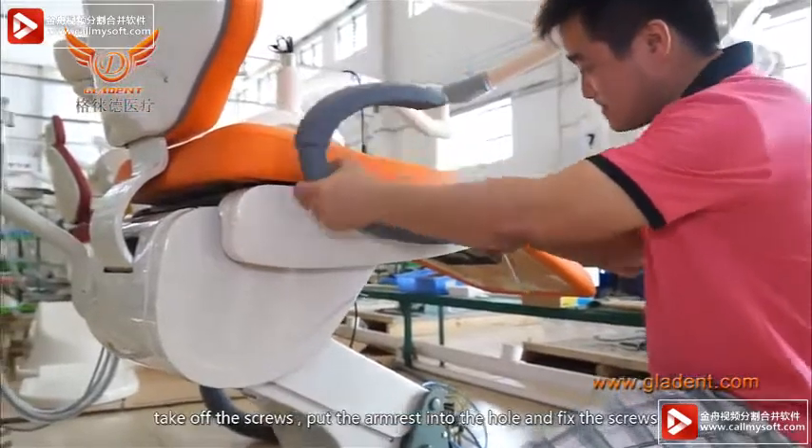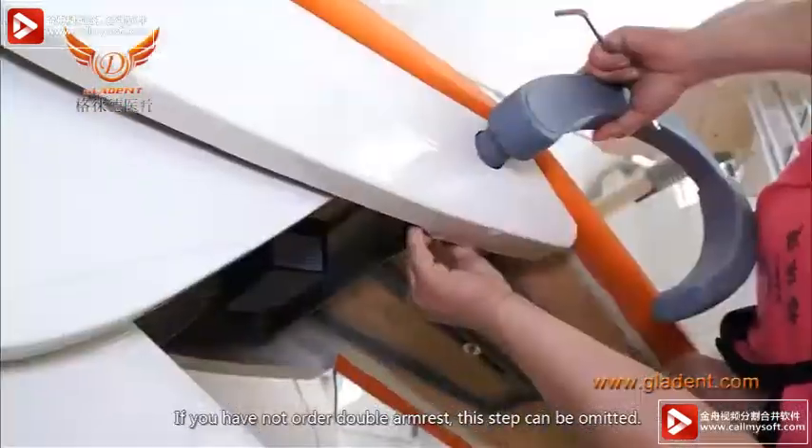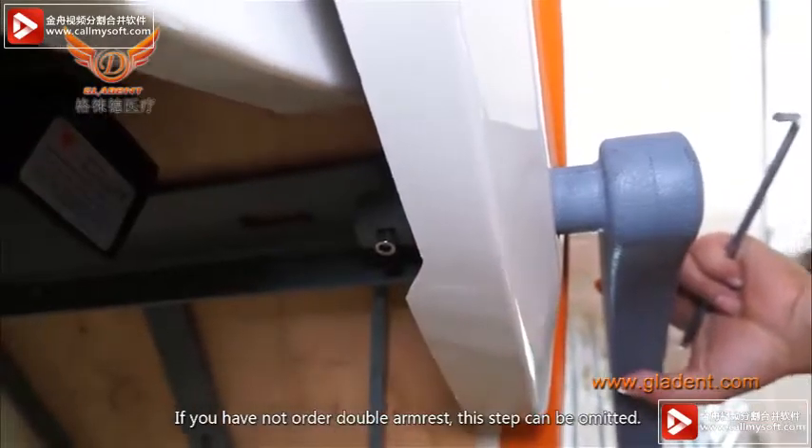Take off the screws, put the armrest into the hole, and fix the screws. If you have not ordered a double armrest, this step can be omitted.